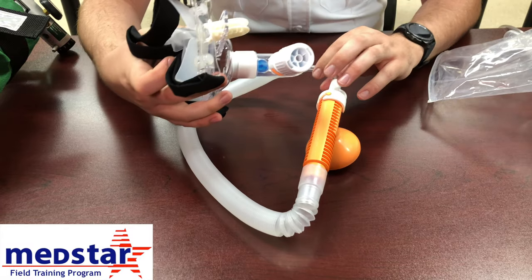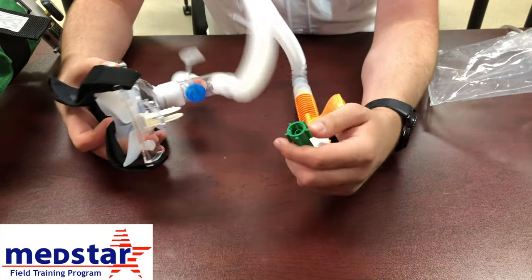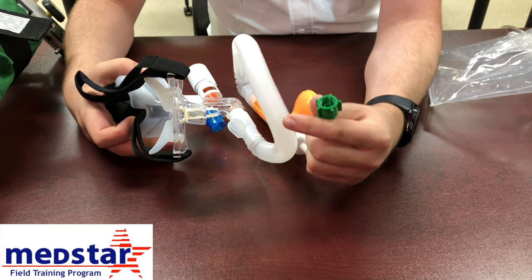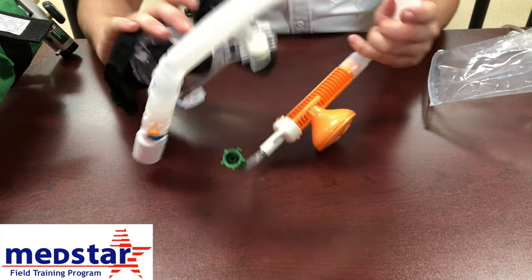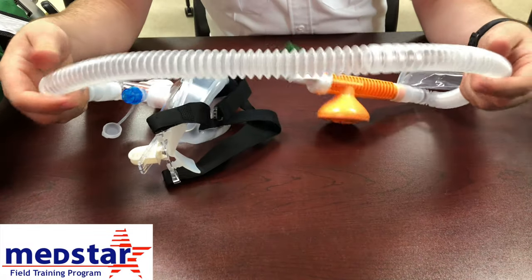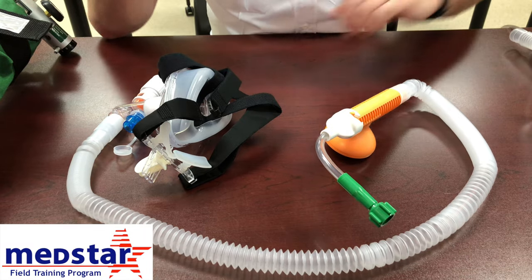The green screw is what you will attach to the high-pressure valve on the oxygen. You have these on both your portable oxygen tank regulator and also in the ambulance. The tubing itself does extend, giving a little more space to reach your patient from the oxygen source.